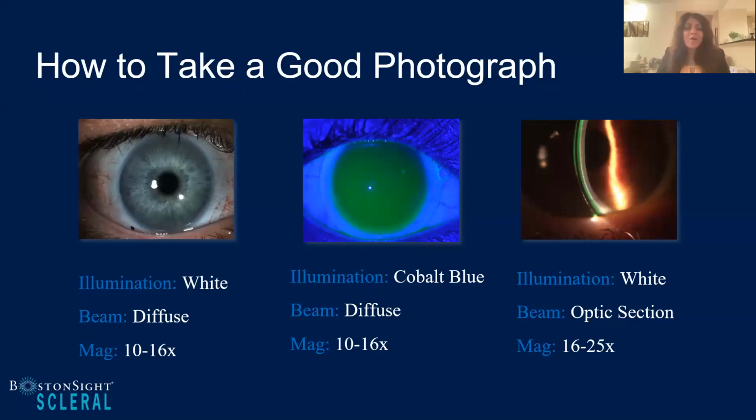We have talked so much about OCTs over this talk, but we have to remember how powerful our slit lamps are. They provide so much, and we can manipulate them in such ways to get so much detail. I fit scleral lenses for 10 years without an OCT. So you don't need an OCT to fit scleral lenses. Please don't take that away from this course. Your slit lamp is so powerful and you can do so much with it, with just changing your magnifications, using filters, changing your beam widths, and really playing around with different filters for sure.